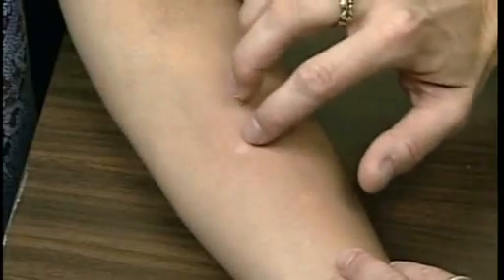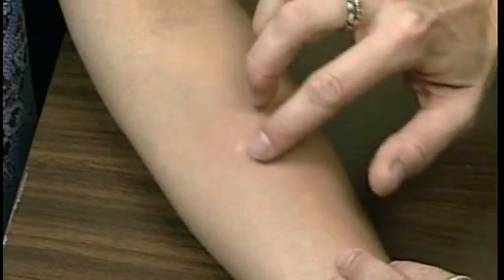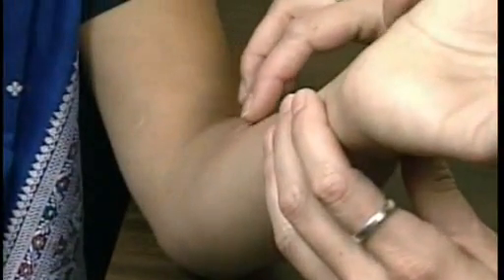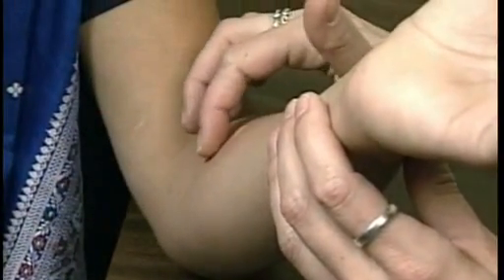Be careful not to confuse a margin of induration with a margin of muscle on the forearm. To check this, raise the patient's arm to a 45-degree angle and palpate again.